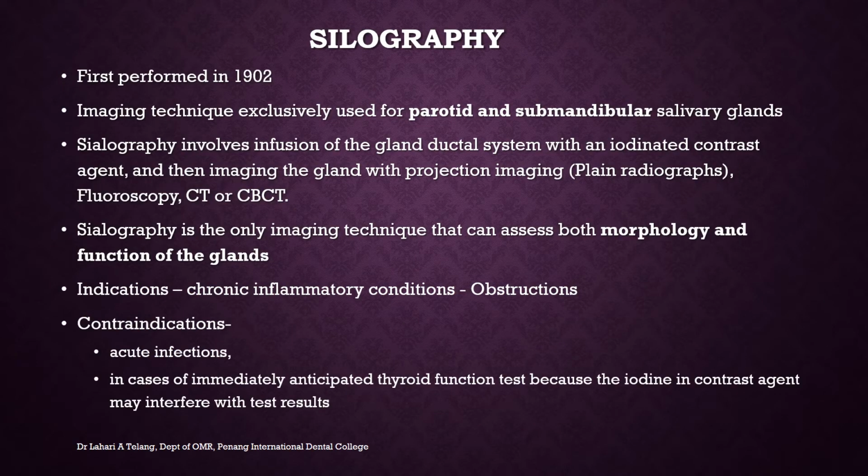Sialography is a procedure that was first performed in 1902. It is an imaging technique exclusively used for the parotid and submandibular salivary glands. Sialography involves infusion of the gland ductal system with an iodinated contrast agent, and then imaging the gland with projection imaging, that is plain radiographs, fluoroscopy, CT, or CBCT.